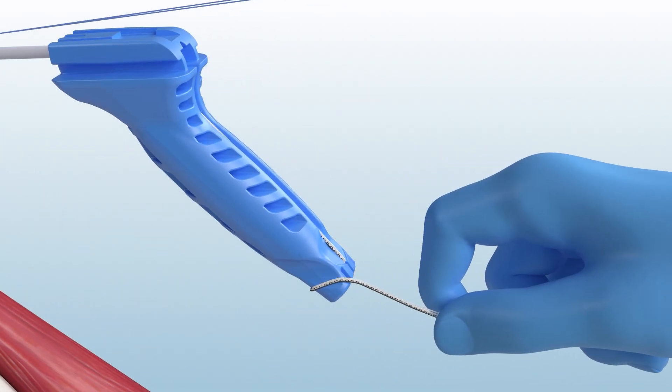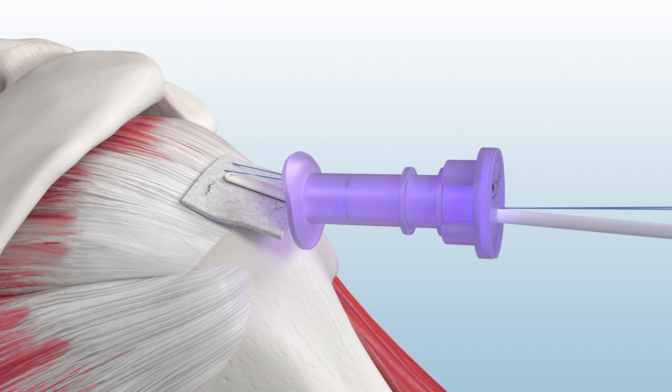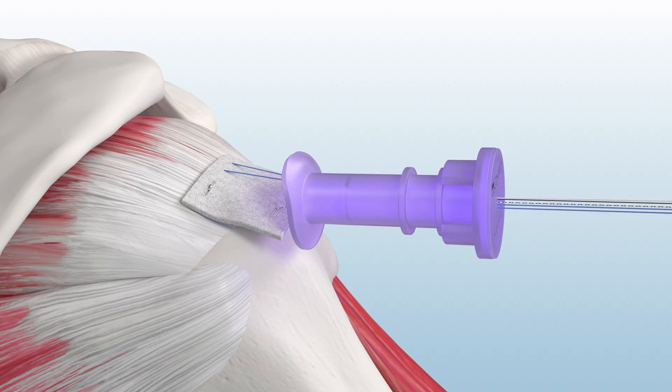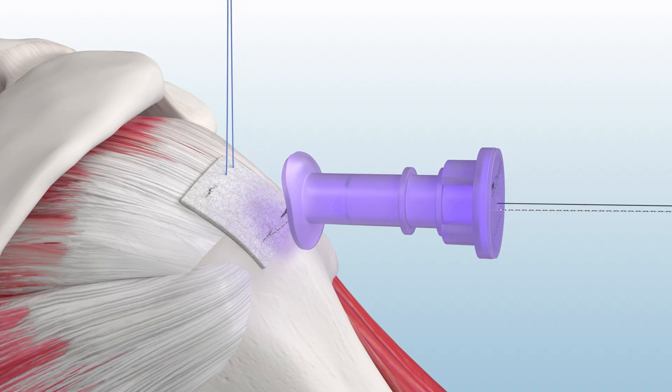Next, un-click the suture from the blue handle and withdraw the delivery instrument from the joint space. Slide the white retention suture to remove it from the implant. Then, tie and cut the remaining medial suture through an accessory portal.